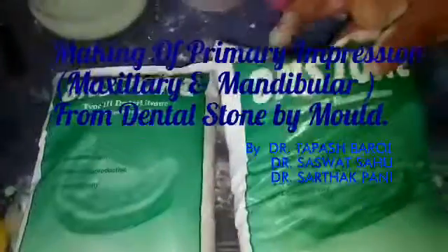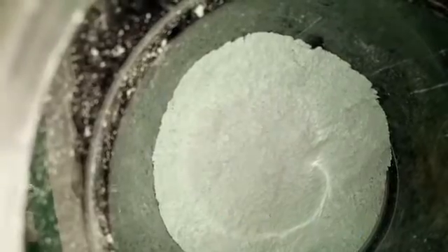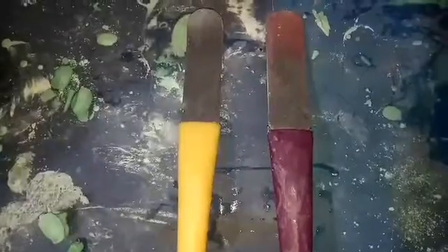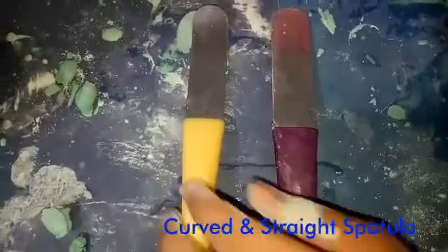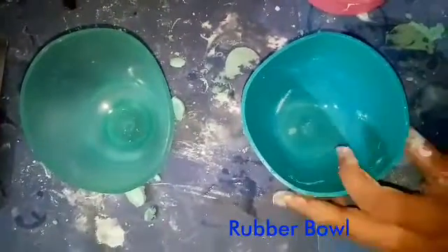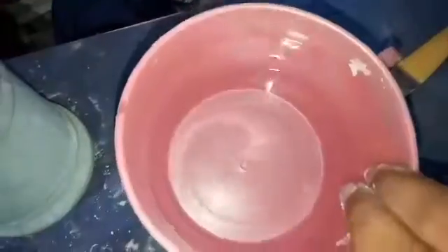Friends, as a dentist, now we need a curved spatula and a straight spatula. Most importantly, the rubber bulb and a mug of water.